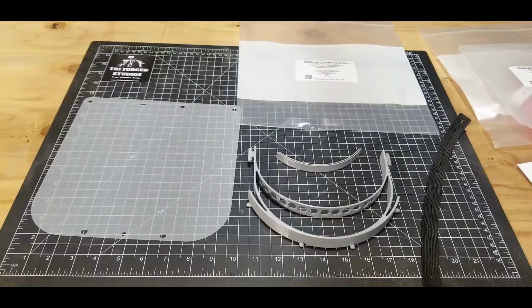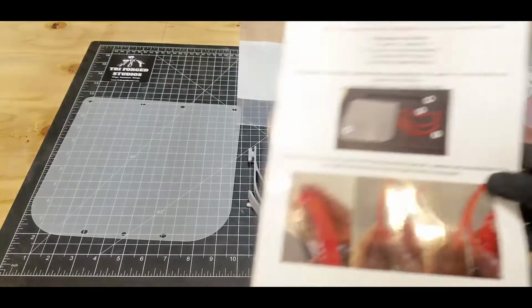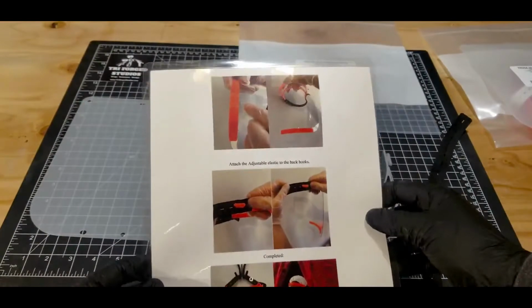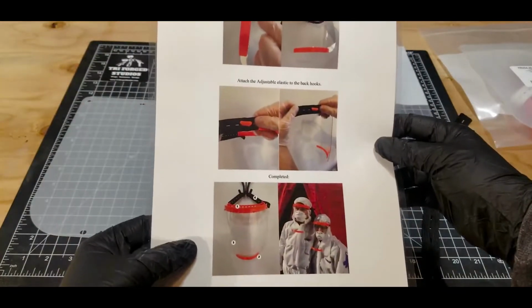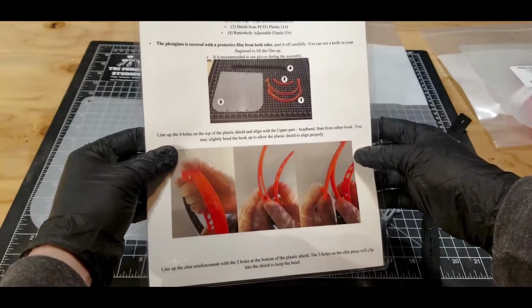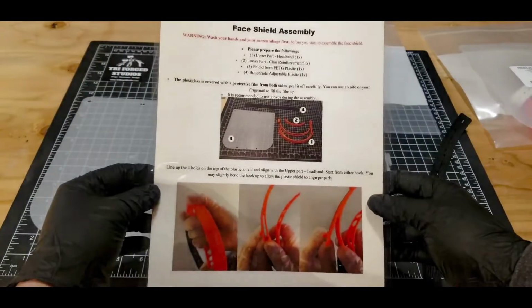Hey guys, in this video I'm going to be outlining how to assemble the Prusa 3D printed face shield. So we did make a couple of these face shields, and I'm going to be showing how, if you do receive them from us, this is how you will be assembling them. In the box you will find a laminated double-sided instruction sheet with pictures and things like that. But what I'm going to do in this video is make this all in video form, just in case you lose this or anything like that.